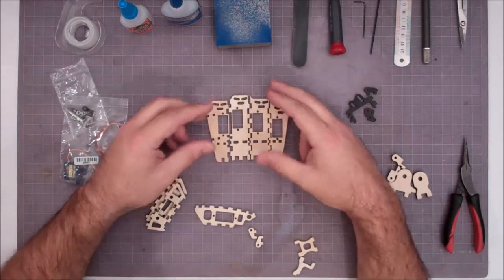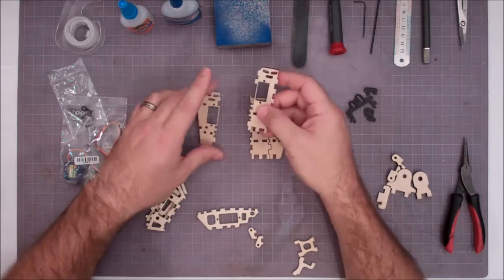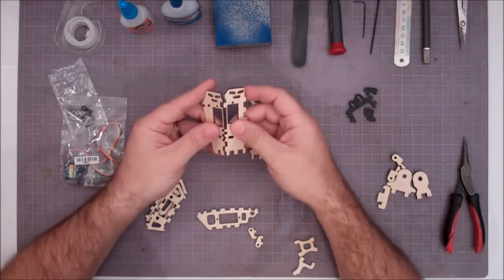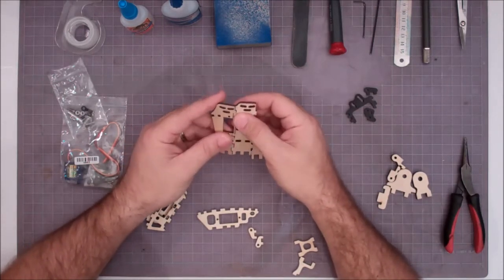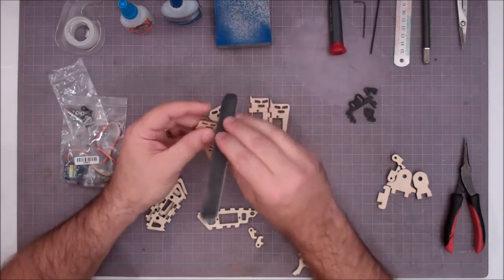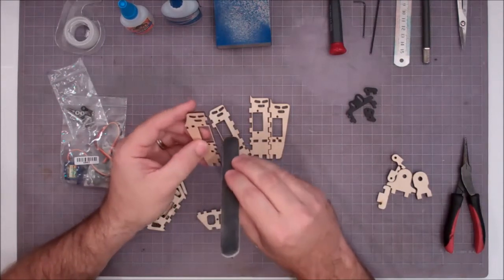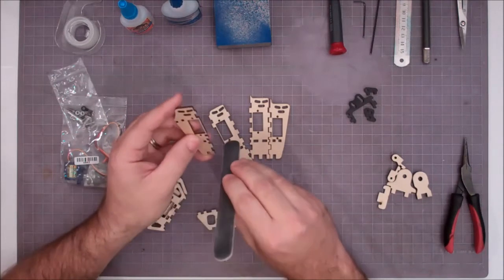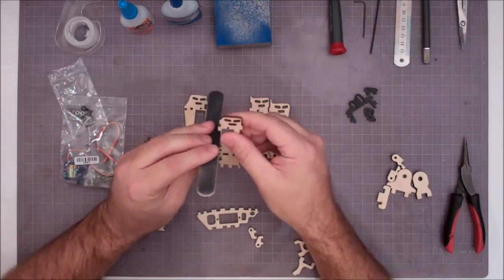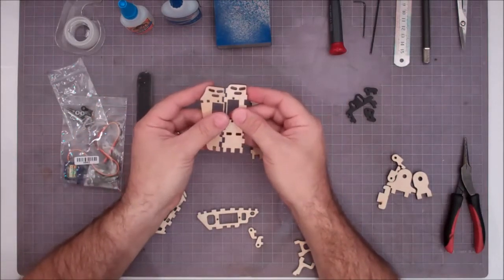One of the first things that you want to do with these plates is make sure that they fit well. This intersection between these joints needs to be fairly smooth. You don't want it to be real tight. If it's really tight, I would take the time to work it through, or get yourself a sandpaper or a file and slightly take down the insides of these slots. There's so many slots here that are engaging on each other. We don't want it to be tight, because if it's too tight, we'll break some tabs when we put it together. So spend a minute prepping these plates to make sure that they go together cleanly without a lot of force.